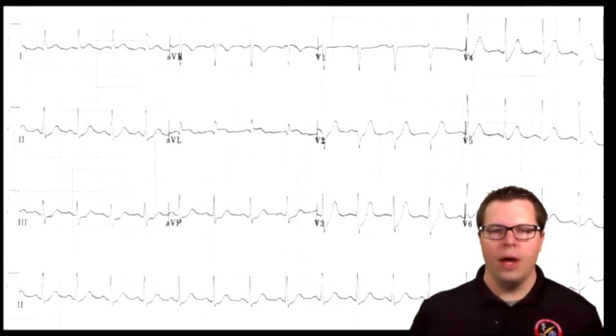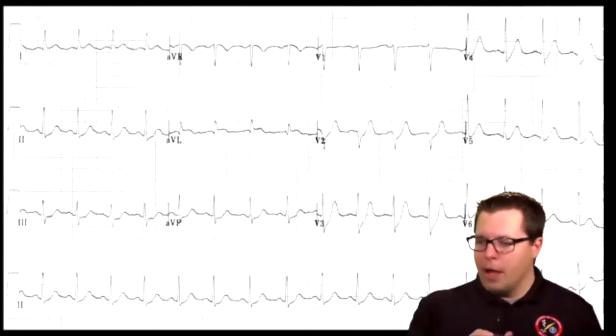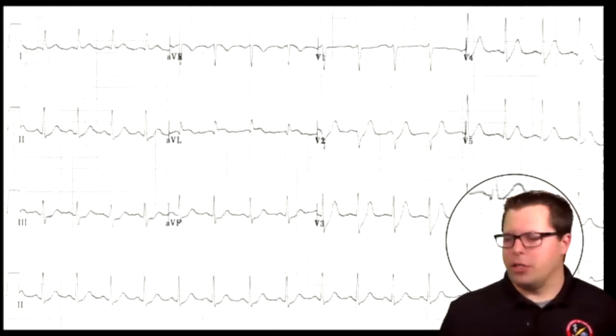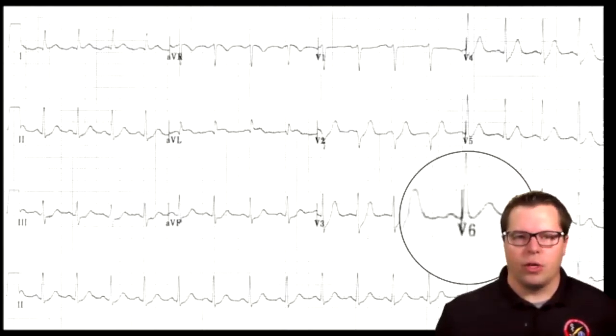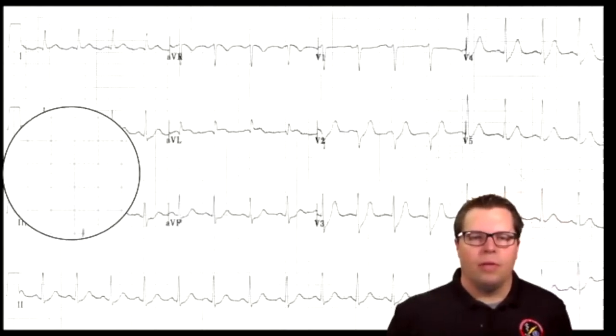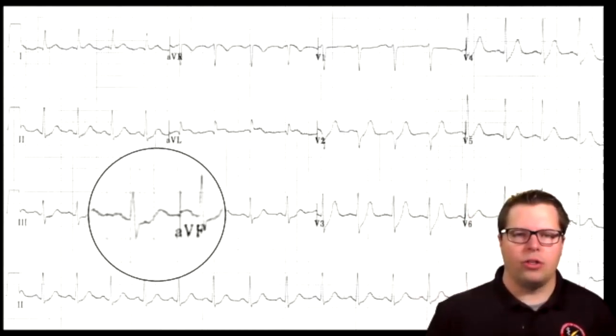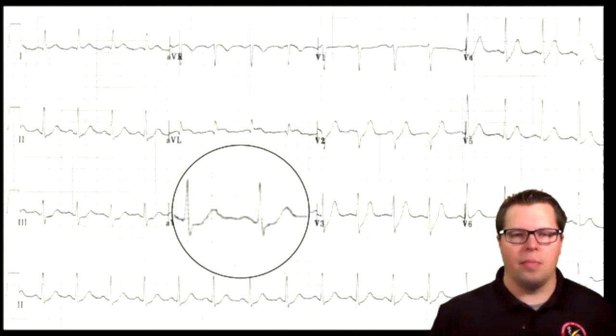Worth noting too, if you look at a second example here, you do notice that there is a little more flat ST depression out here, and there's some down here. Just trust me, it's there. And then when we look through the inferior leads over here, yeah, kind of flat-ish, and that's all kind of bad.